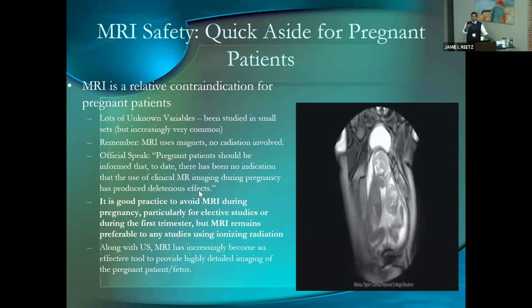And so again, it's all about this risk-benefit analysis that I'm going to keep harping about here. Along with ultrasound, MRI has really become a mainstay for obstetric patients. This has changed. When I practiced, we would be ready to put an obstetric patient in the CT scanner all the time. And now we'll say, let's take a beat.